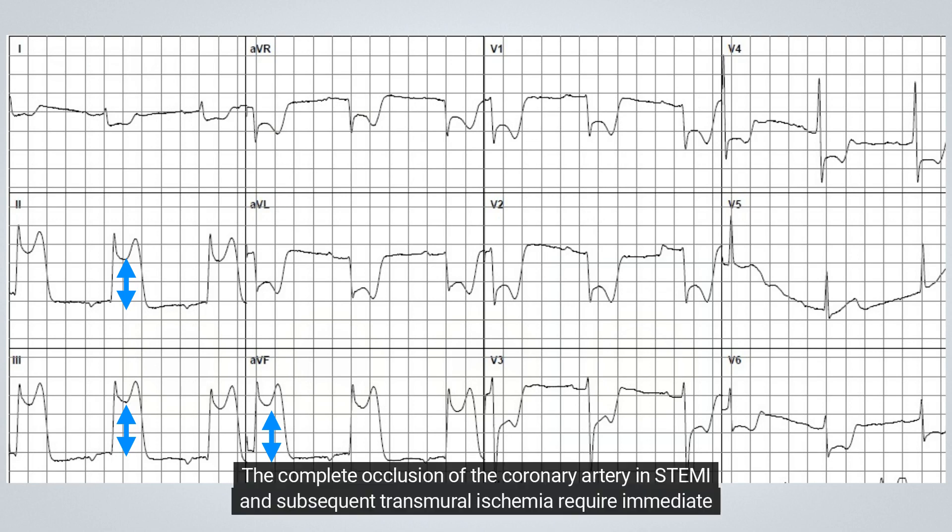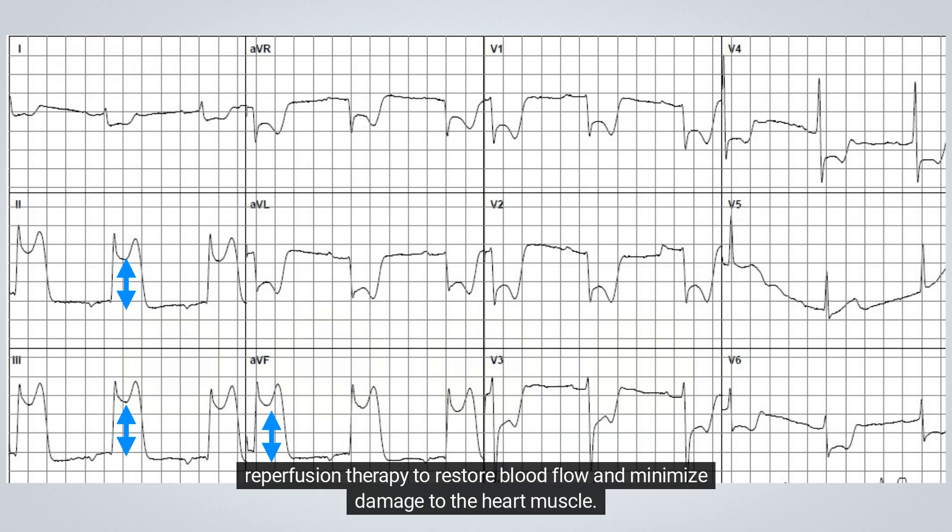The complete occlusion of the coronary artery in STEMI and subsequent transmural ischemia require immediate reperfusion therapy to restore blood flow and minimize damage to the heart muscle.